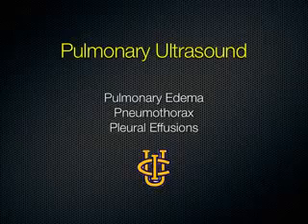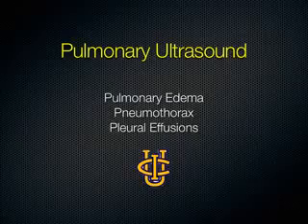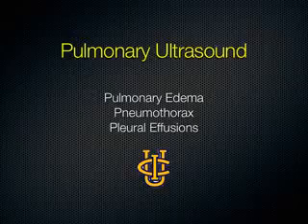And it's just now catching on here in America in the last, say, decade that we understand that you can actually ultrasound the lung. The prior understanding, and I know all of you have had this multiple times, is that air doesn't transduce ultrasound well, so how could you possibly ultrasound image the lung? Well, what I'm going to teach you today is that we don't so much look at the lung as we look at the artifacts created by the ultrasound waves that travel through the lung. And that tells us a lot about what's going on with the underlying tissue.